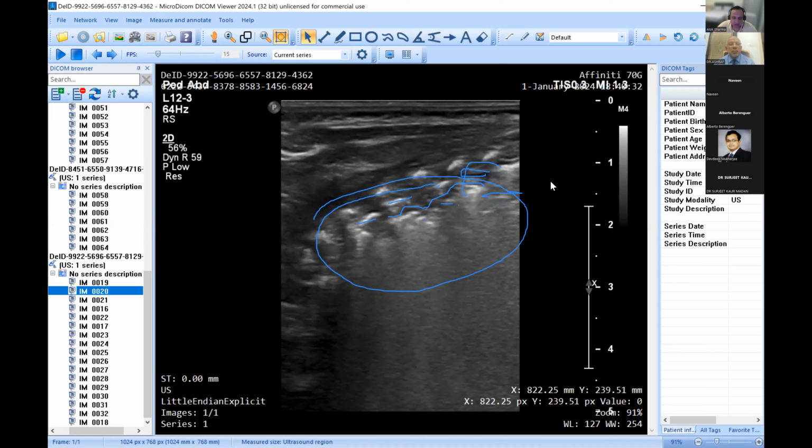B profile, yeah. It's basically lung that potentially could be recruited in this baby, which, if you're at the back and you've been nursed prone, you are as well recruited as you can be. But sometimes if you've moved from supine to prone and you do a scan immediately, you'll still have areas of atelectasis. But beautiful image. The back is always my biggest challenge in extremely preterm babies because of the convexity, the arching of the baby, the amount of soft tissue that you often get. And you've basically got around that really nicely. So my compliments. I probably was lucky.